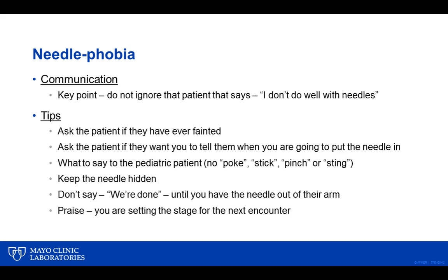As a patient, if they want you to tell them, ask the patient whether you should tell them before you stick them. Some patients don't want to know. Children, a lot of techs I know just say 1, 2, 3, and then they poke. They don't say things like stick, poke, or pinch. They don't describe what's going to happen. They just let them know we're going to draw blood. I'm going to count to 3, 1, 2, 3, and they do it. Don't give them that chance to hear that it's going to be painful.